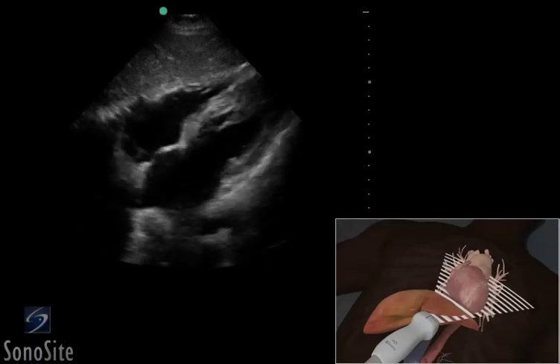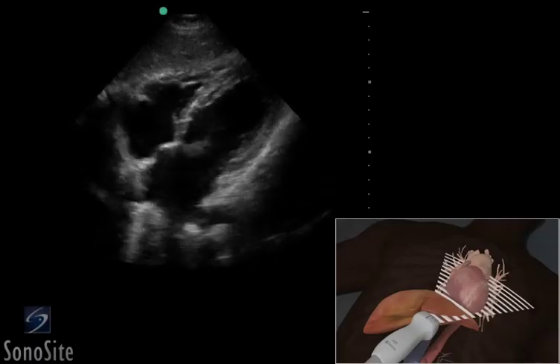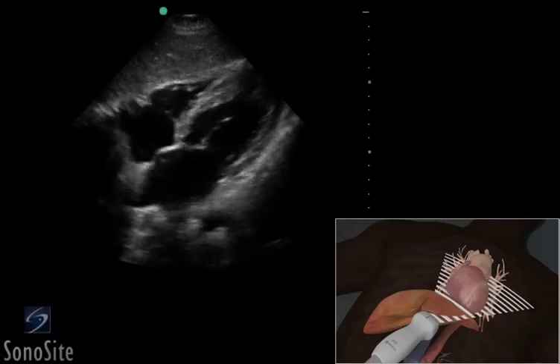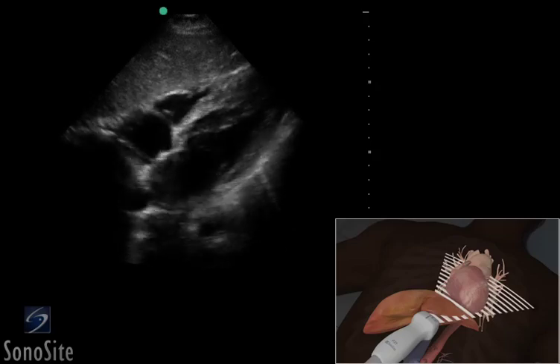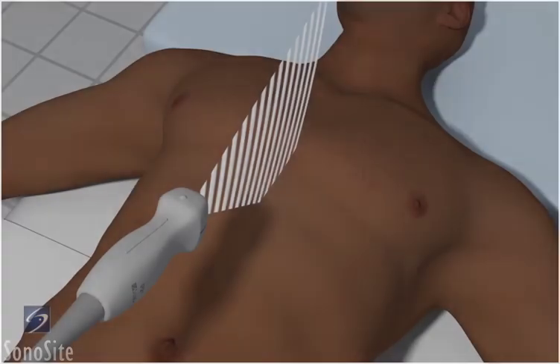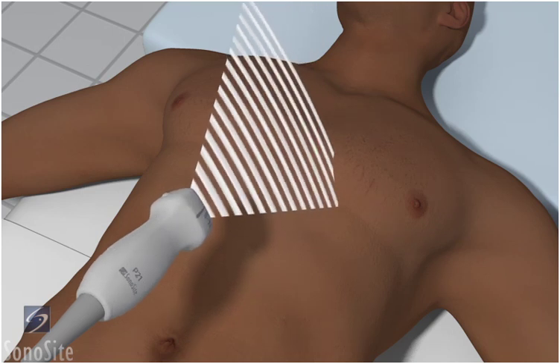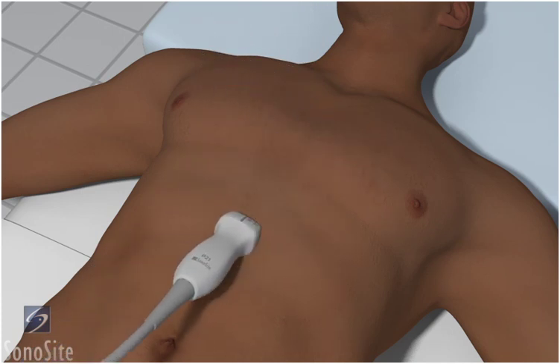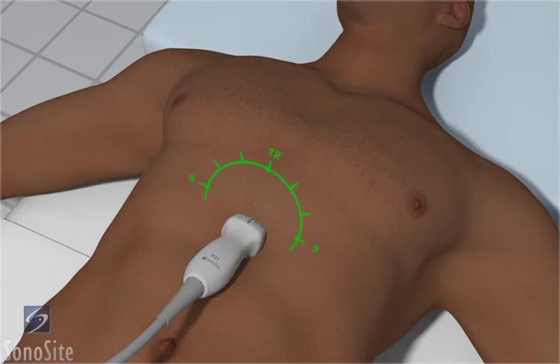A phased array transducer with an abdomen exam type is used to perform the subxiphoid or subcostal view of the heart in the FAST exam. Place the transducer in the subxiphoid position with the orientation marker to the patient's right side at a 9 o'clock position.